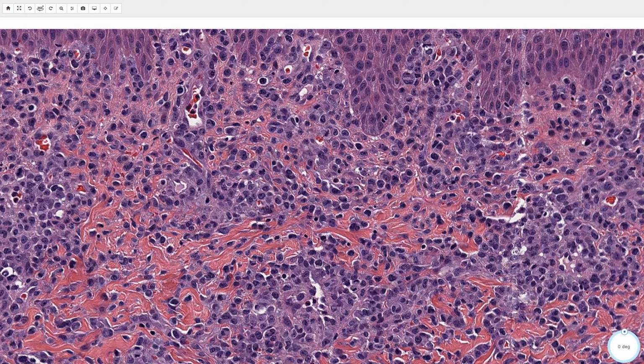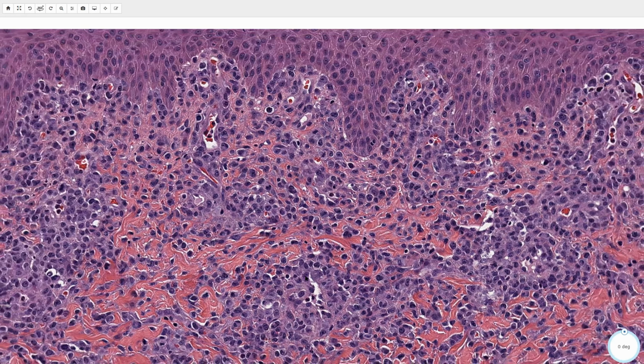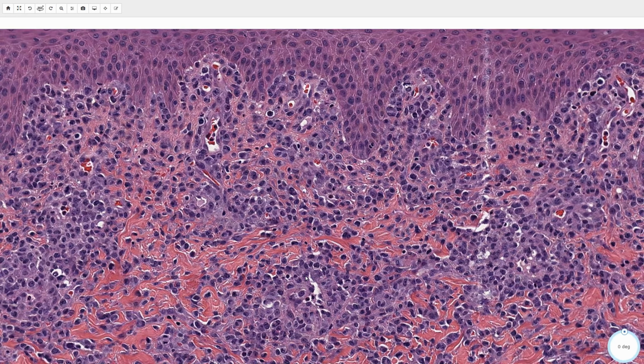So these, I think we can still tell are lymphocytes, and they look a little bit more like those lumps of coal. But again, here, immunophenotyping is going to be helpful because we're going to need to determine with certainty that these are B versus T cells. So again, a CD3 and a CD20 would probably be your first step. And this one, I would probably be suspicious of an ALCL, so I would probably get a CD30 in the beginning as well, along with some unstained.